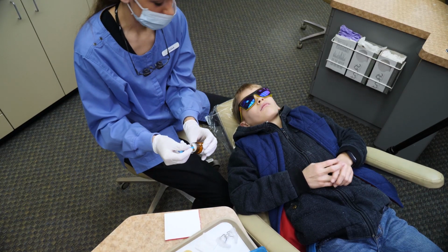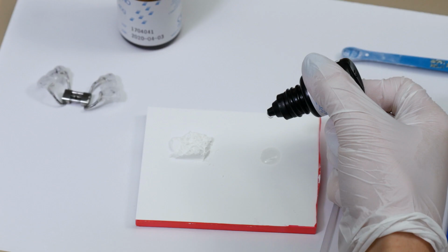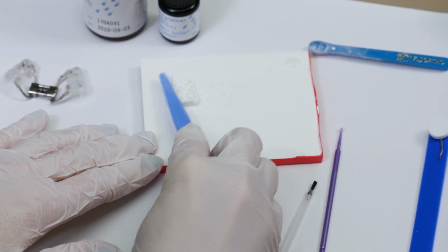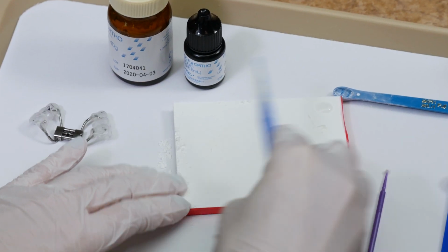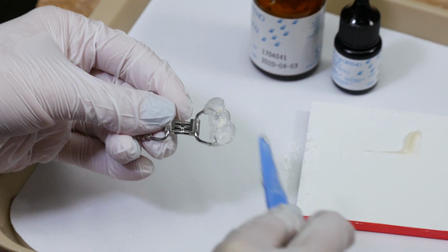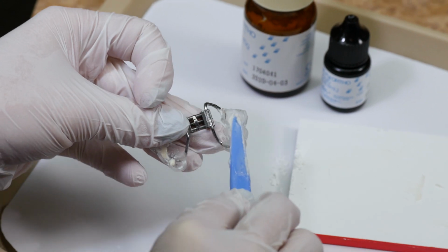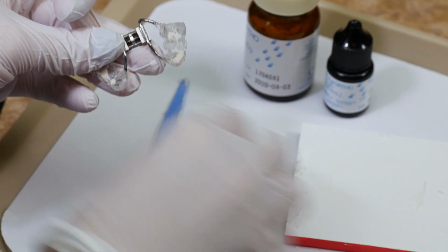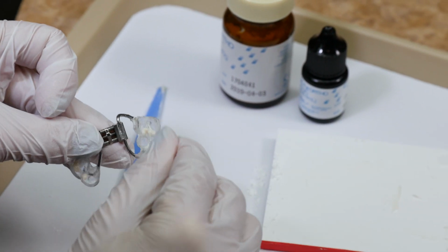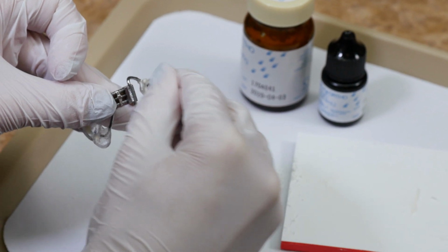Following this, the Fuji modified glass ionomer cement must be mixed in adherence to the manufacturer's timing for total mixing time and placement. Initially overfill the appliance slightly, and just before placement it is essential to remove all excess adhesive with a brush, leaving only a very thin coating of Fuji on all surfaces.